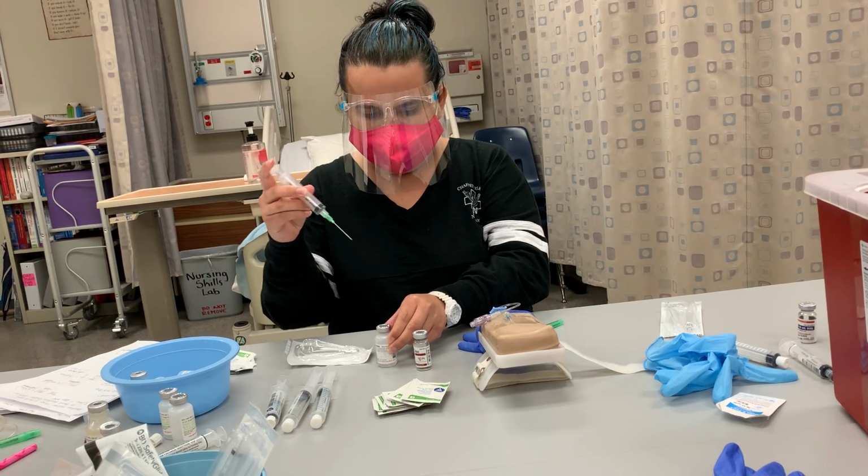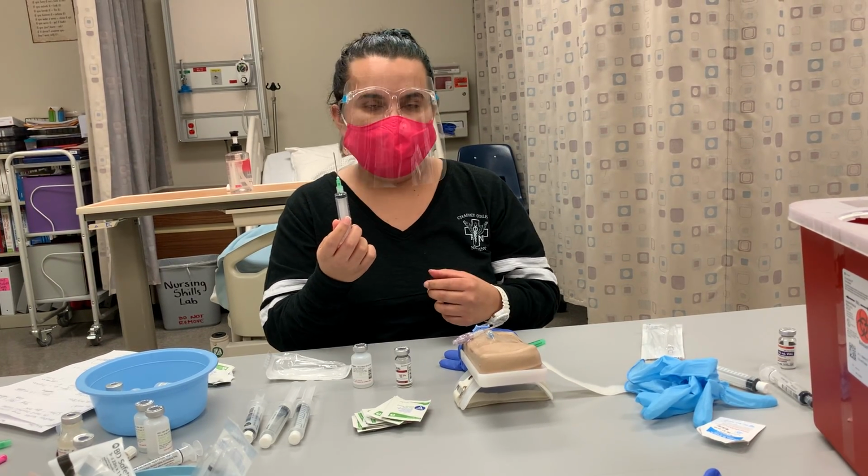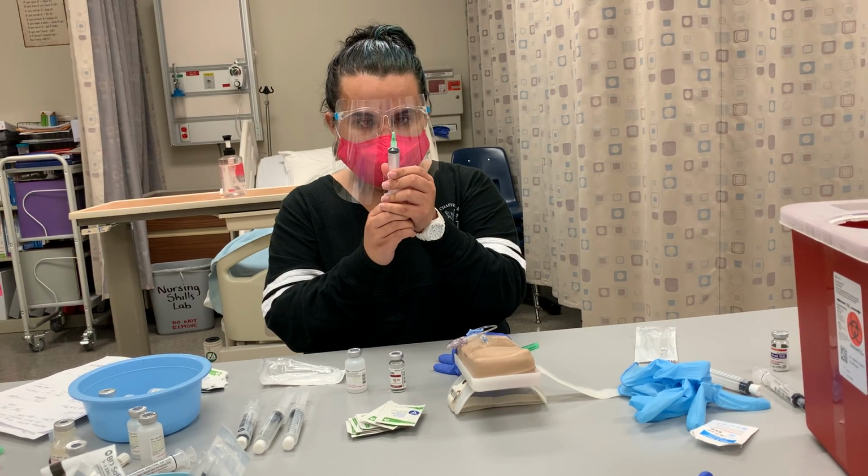Okay. And since I'm going to be retracting 0.8 mLs of morphine, I'm going to be retracting 0.8 mLs of air.